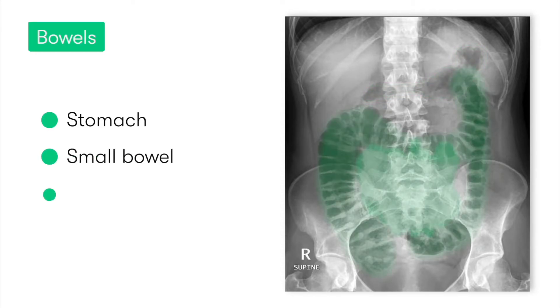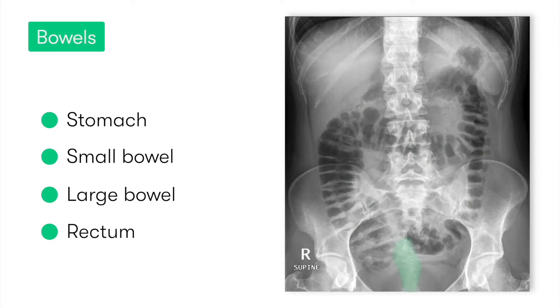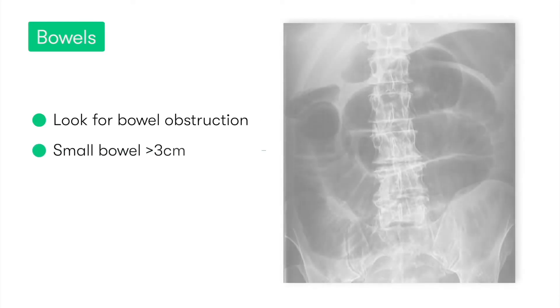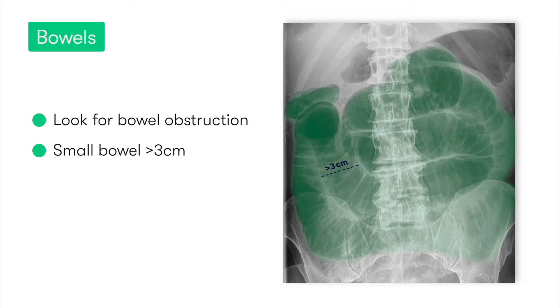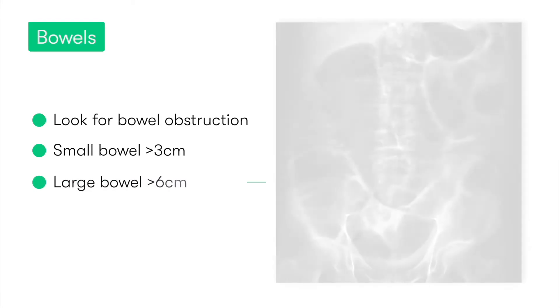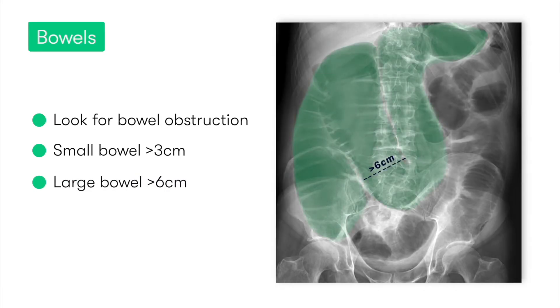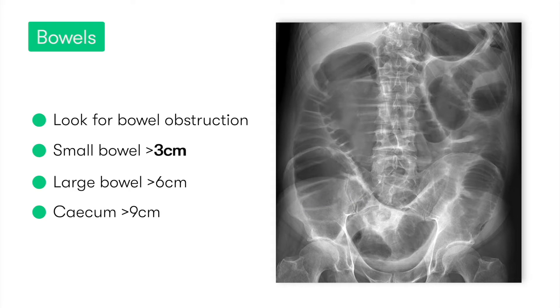Moving on to B for bowels, we can look at the stomach, the small and large bowel, and also the rectum. The main things we're looking for are evidence of bowel obstruction: for small bowel, this would be suggested by a bowel lumen greater than three centimeters in diameter; for large bowel, obstruction is indicated by a diameter greater than six centimeters; and for the cecum, which is naturally larger, it would need to be distended to a diameter greater than nine centimeters. We call this the three-six-nine rule.